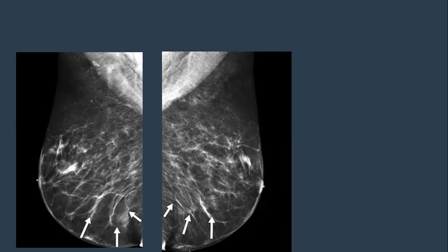Why? Is it a dermal disease? Some sort of skin disease? Does she have any skin disease? Scar or something? She has no skin disease. No previous surgery?